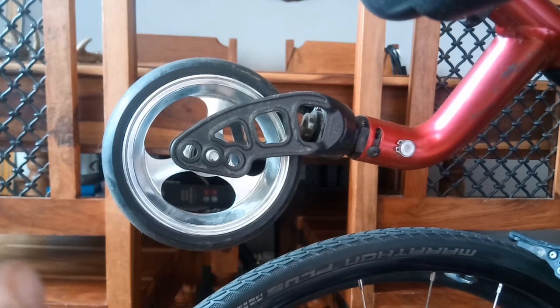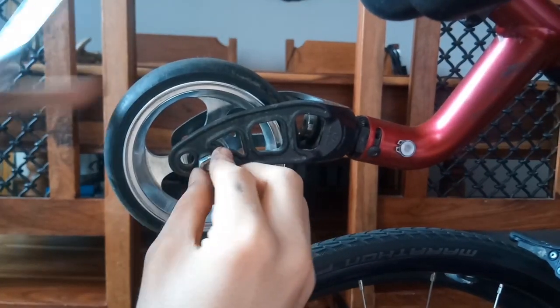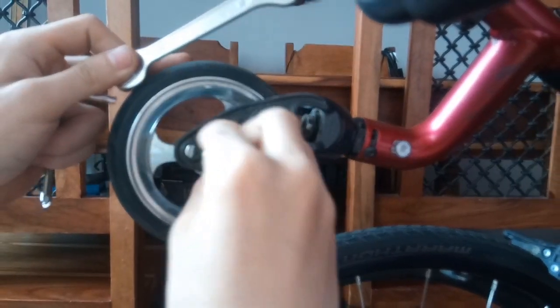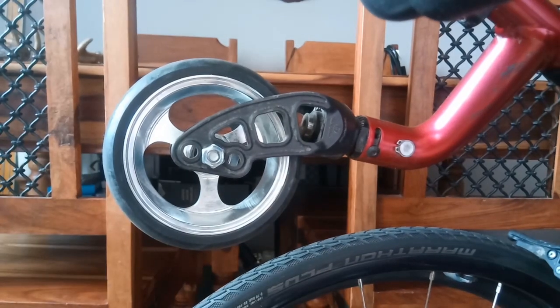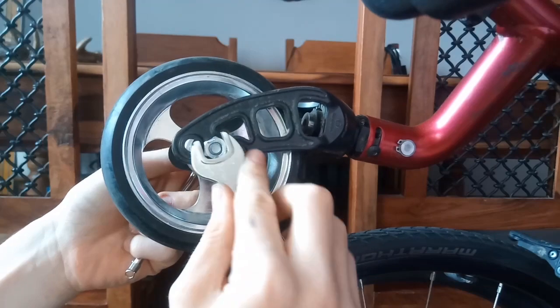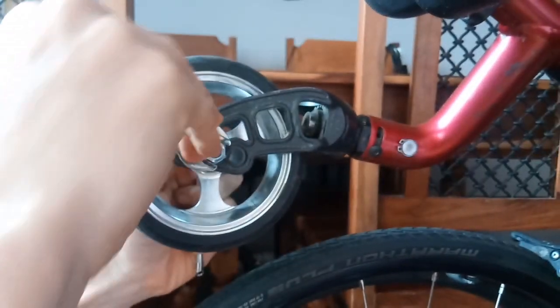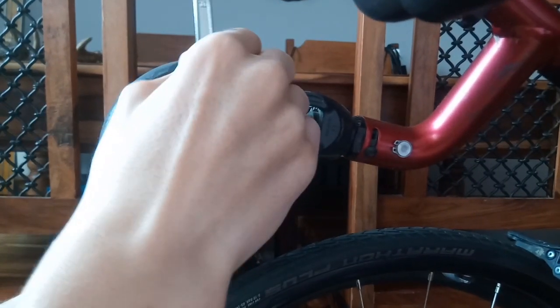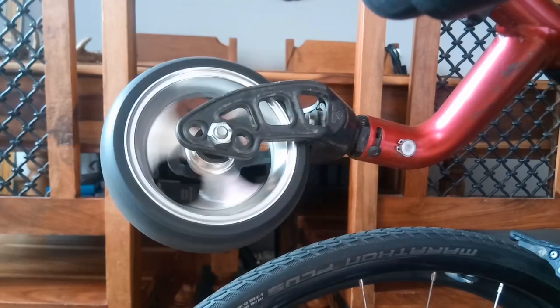Okay, so mine has these little grooves on the nut, just to show you where it's meant to go. But what I'm doing is just kind of screwing it on very lightly at first, until I start to feel some resistance from either a bit of dirt in the screw, or just general resistance. Now, obviously you don't want to do this too tight that it grabs onto the wheel, but you also don't want it too loose so that it'll fall off the wheel. So what I usually do is hold it in and then go until I feel some strong resistance, and then just like quarter of a turn more. So it still rolls smoothly.